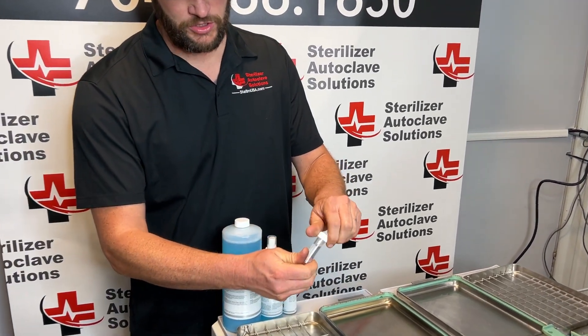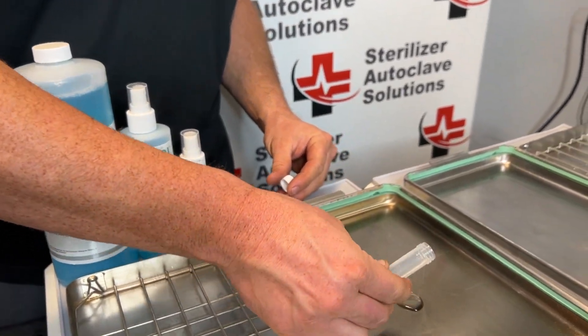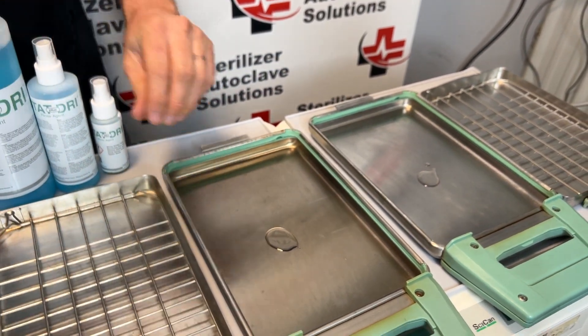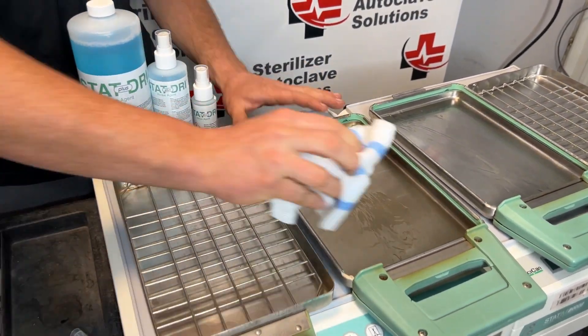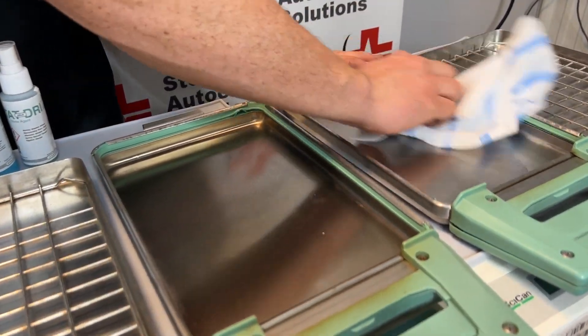To show the effects, I'm actually going to use the lubricant that comes with a new cassette seal. I'm going to pour a little bit in each of these and actually smear this around. Using a cloth, I'm just going to wipe up like you would after a cassette seal is installed.